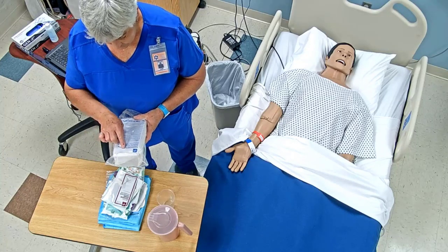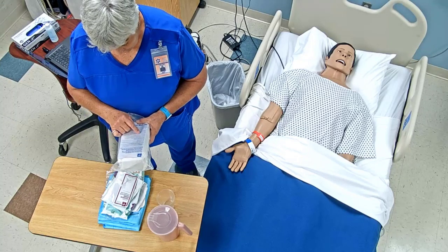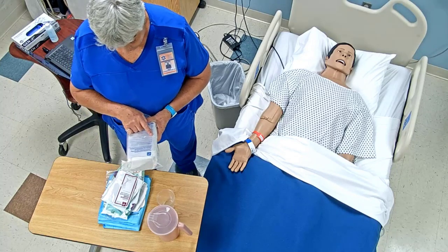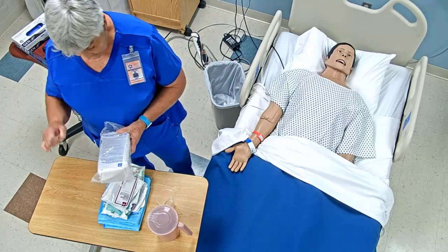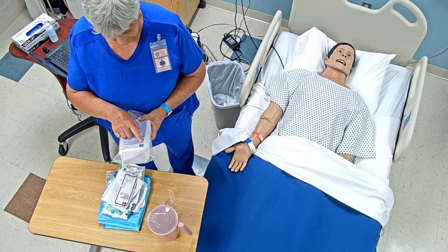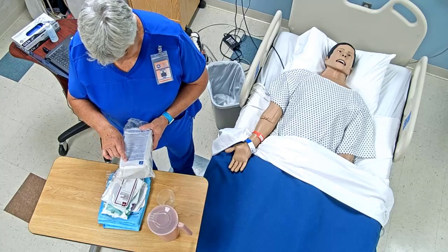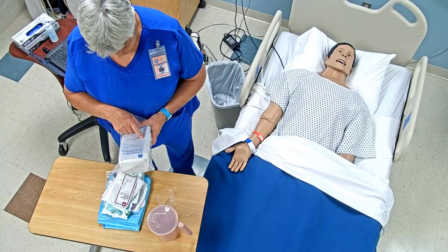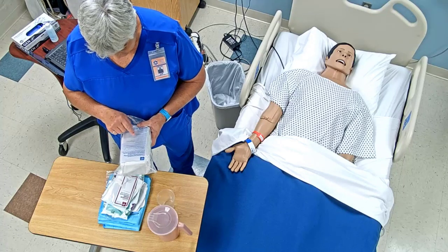This tells me the type. It also tells me that this is a 14 French urethral catheter. That's the size of the catheter. And this is a Medline pre-connected urethral catheterization kit, so that's the type that I have here. So the size is 14 French. It's also going to tell me that it's got gloves.